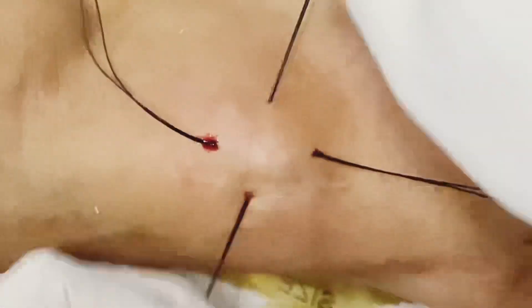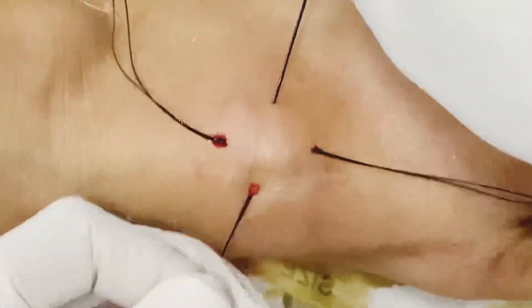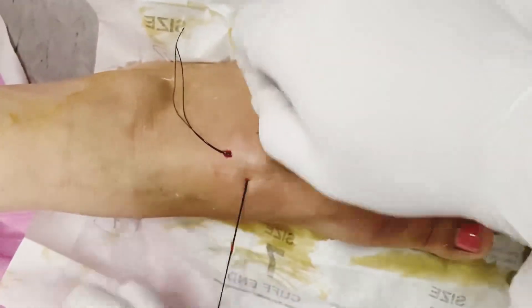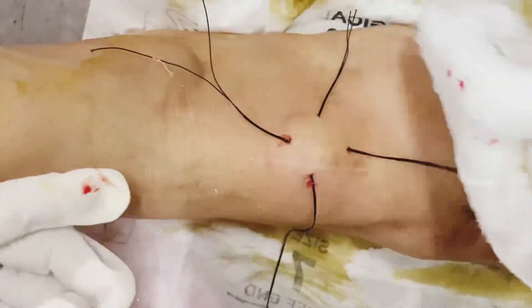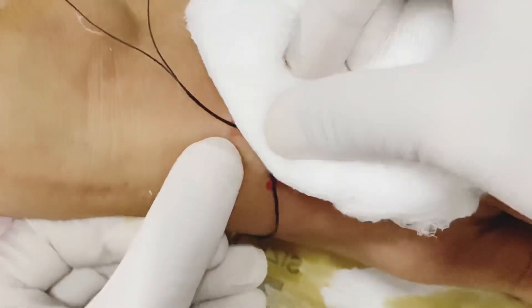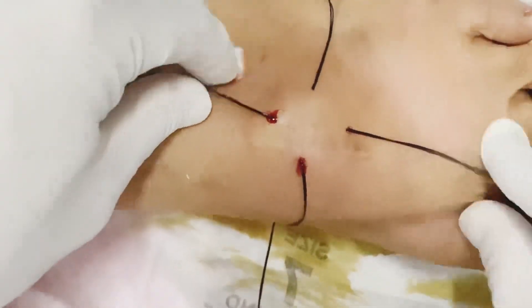The contents of the ganglion are expressed out by moving the thread and by applying firm pressure alternately. Try to take out all mucinous content from the cyst.